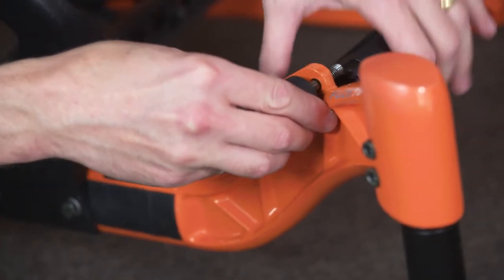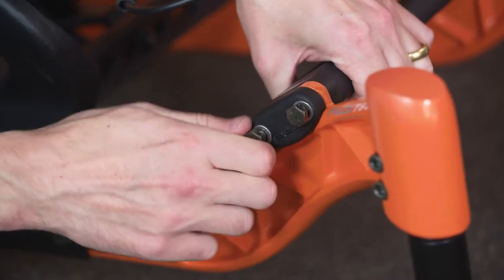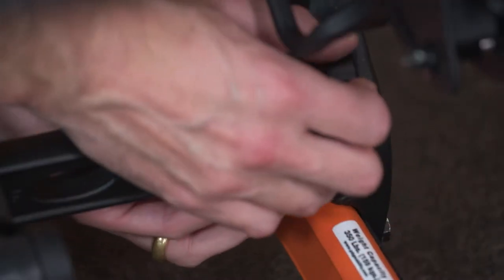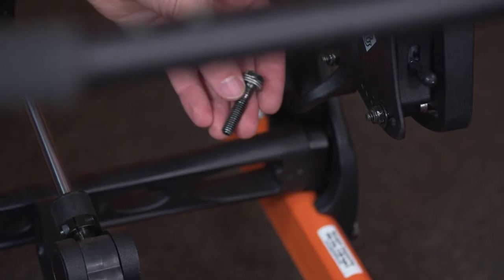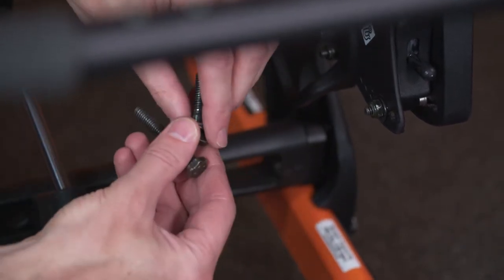Loosely install and tighten each of the fasteners by hand. Take care not to damage the threads in the end of the crossbar. Repeat the process of replacing the fasteners for the lower frame rear crossbar.